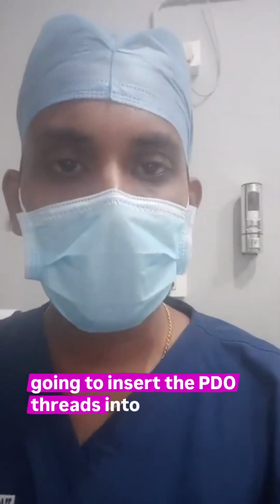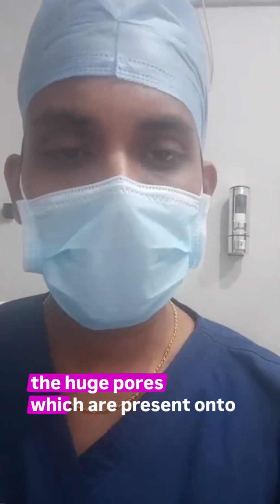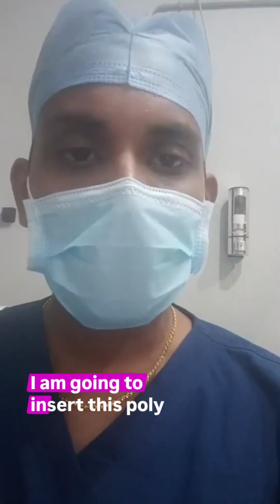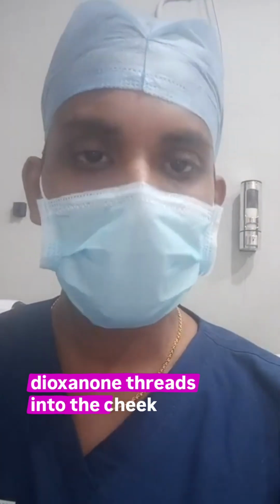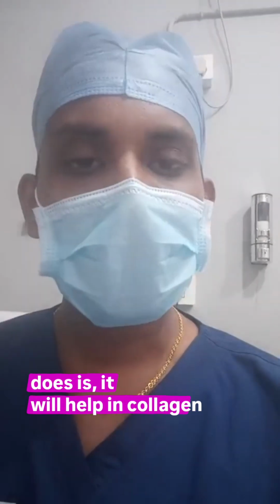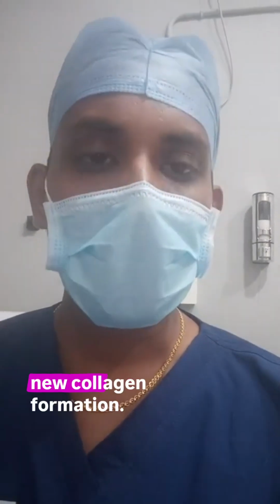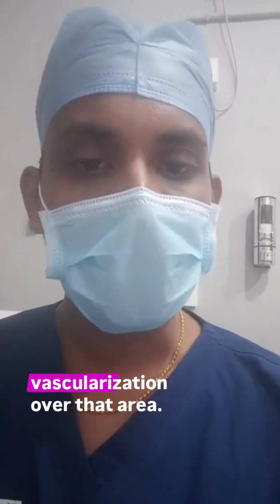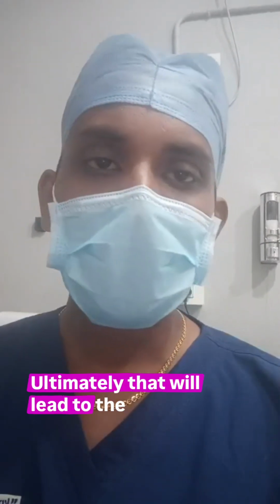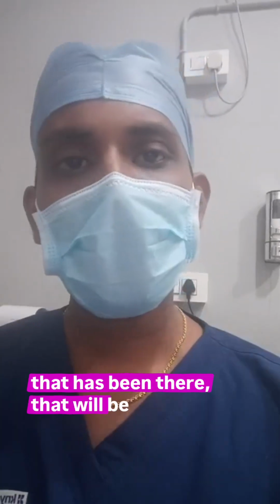What we are going to do is insert the PDO threads into the face region, that is the cheek area, especially because there are huge pores present on the cheek area for this patient. I am going to insert these polydioxanone threads into the cheek region. What polydioxanone thread basically does is help in collagen formation. After around 3 weeks, there will be new collagen formation. Also, it will help in new vascularization over that area. Ultimately, that will lead to collagen formation, and the depth of the pores will be shortened.